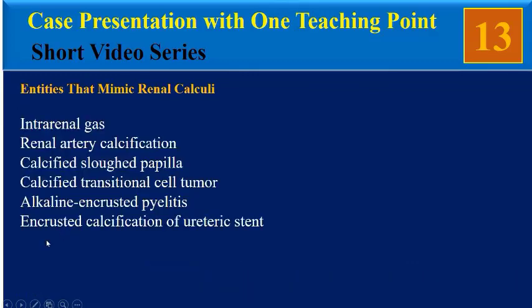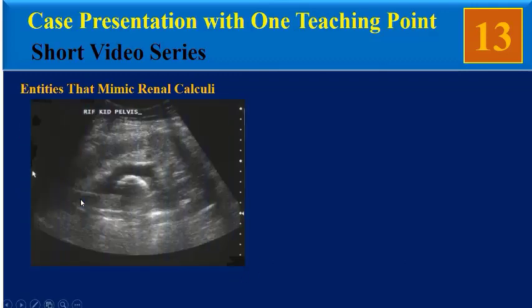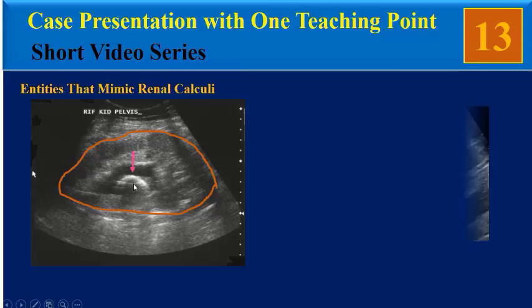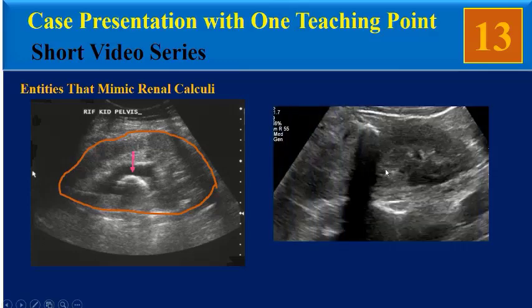The last entity is encrusted calcification of ureteric stent. In this transverse sonogram, we can see the kidney with hydronephrosis and a JJ catheter in the renal pelvis which is calcified. Our patient is not compatible with this entity.